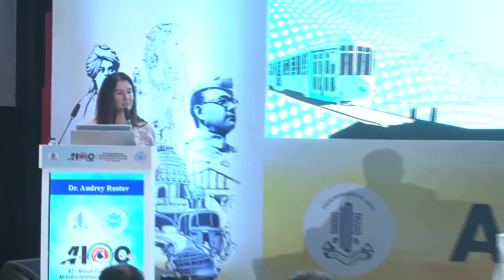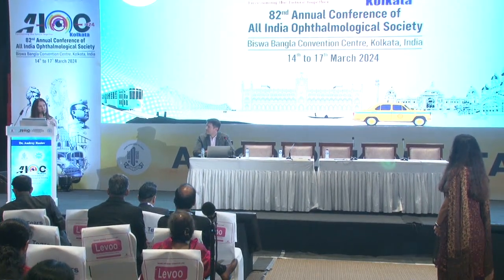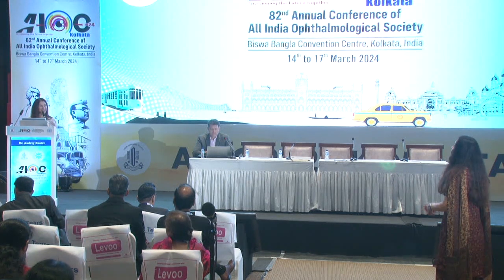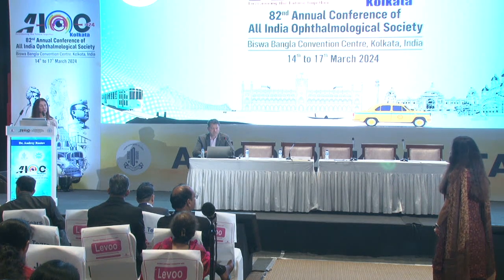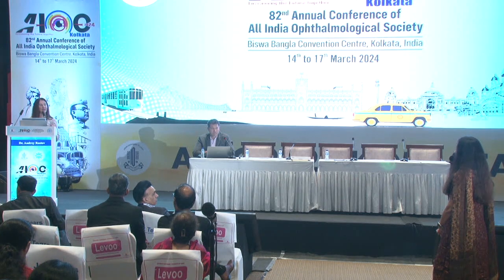That was awesome. My question is sort of post-operatively, fundus examinations and what if they need retina surgery? Is that a big deal when you have the small aperture lens? As long as they dilate well, the answer is no. And I discussed this with some retina colleagues. You have to make sure the patient can dilate well. If they don't dilate well, or there's any concerns, like if they have macular pathology preoperatively, that case I showed, then I'm not going to put one of these in. However, if they have a normal macula, they dilate well, then I don't think it's an issue.